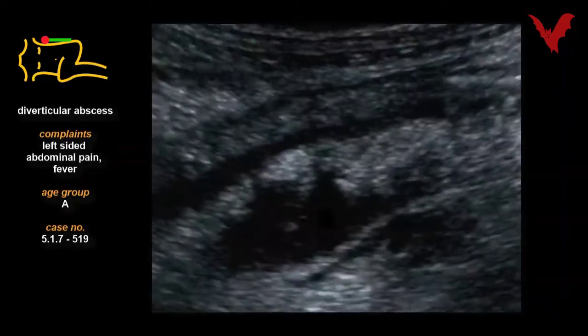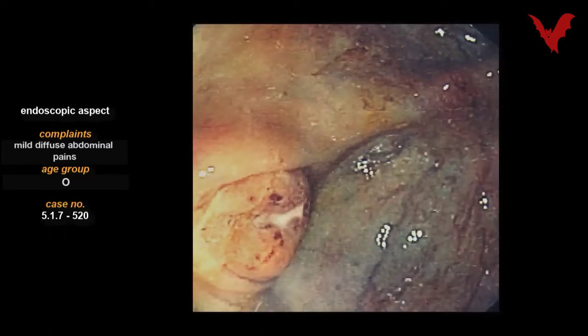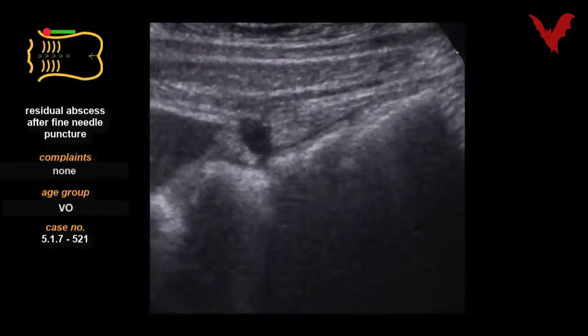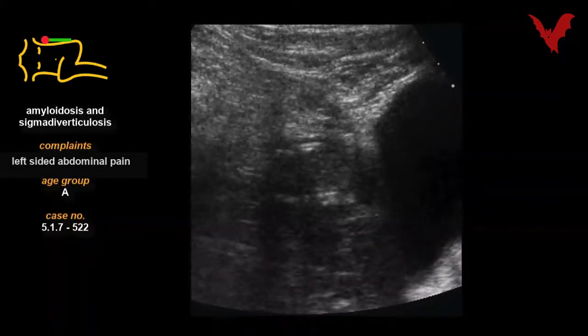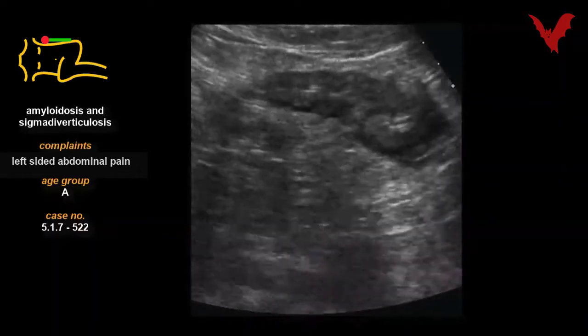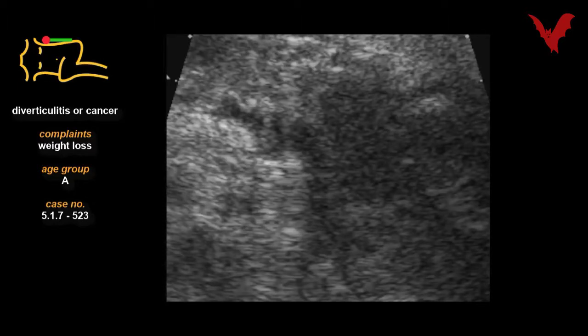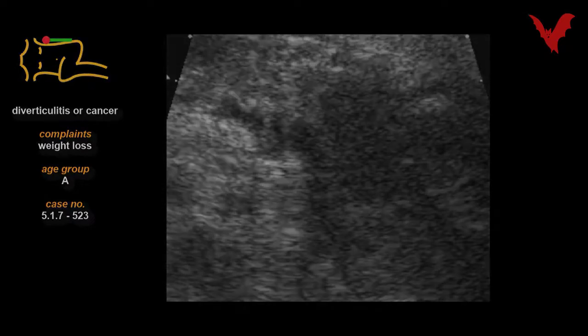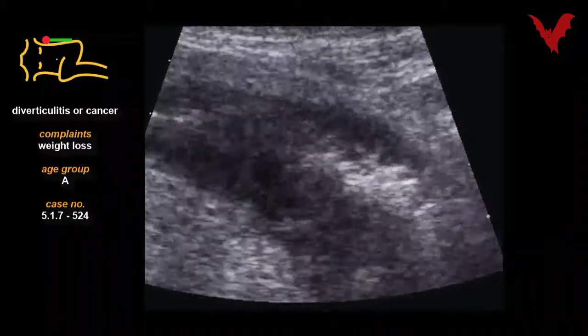Case 517 reveals the involvement of the Douglas cavity in gallbladder perforation. Case 518 shows another case of diverticulitis not so easily recognized. Case 519 again shows the limited use of color Doppler in these cases. Case 520 repeats the combined use of echography and endoscopy. Case 521 shows the result after fine needle puncture of an abscess and its evacuation. Case 522 is unique in finding both diverticulosis and amyloidosis of the large intestine. Cases 523 and 524 show the classic echoscopic differential diagnosis problem between cancer and inflammation — unluckily it was the former.